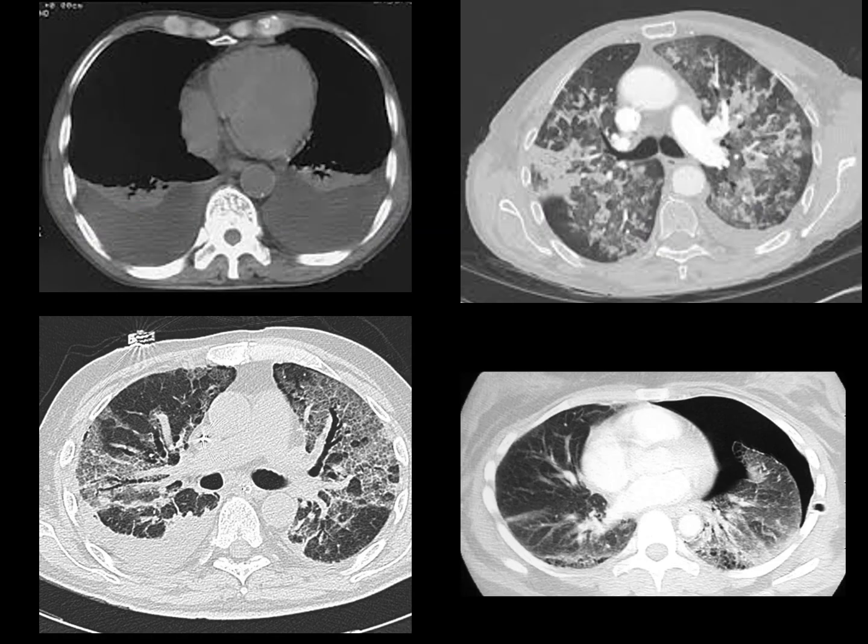Bedside ultrasound is so valuable because acute disorders tend to have superficial locations. Pleural effusions and pneumothoraces always reach the pleura. Acute alveolar consolidation touches the chest wall in over 98% of cases. And acute interstitial disorders involve not only the deep tissues, but the subpleural areas as well.